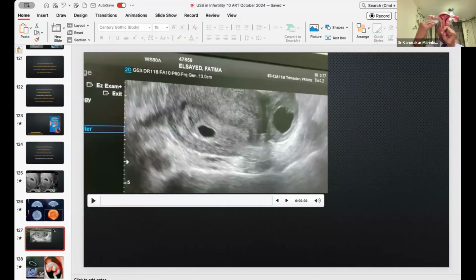So not only do you scan, you see the cervix, uterus, cervical canal, endometrial canal, uterine arteries, medial endometrium, central endometrium, lateral endometrium, adnexa, ovary. No fallopian tube should be visible normally. Then above the ovary, below the ovary, no pathology. You go all the way up to the pelvic diaphragm, you go above the ovary. Do it on the opposite side.